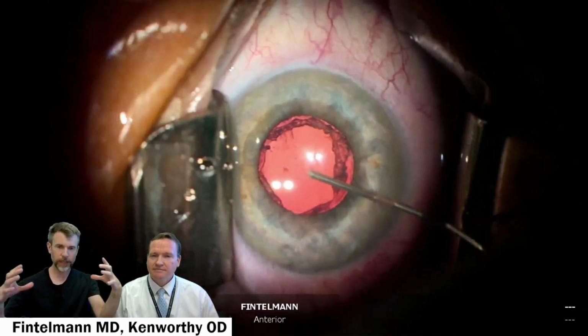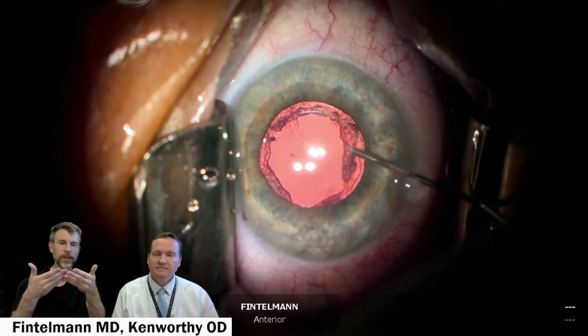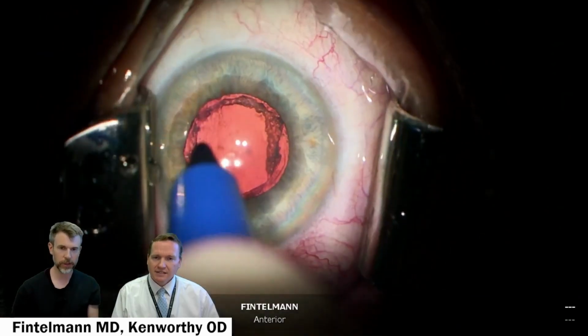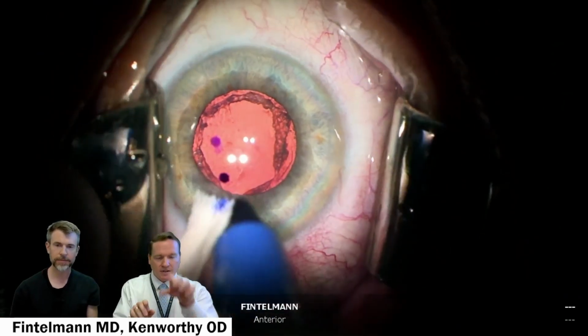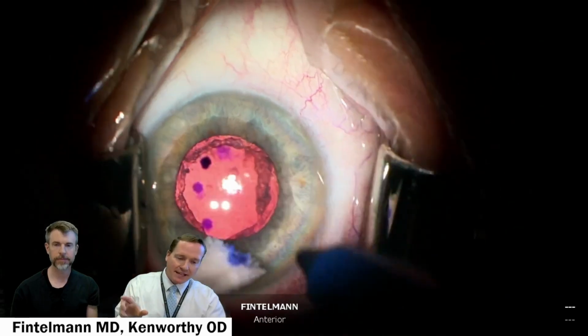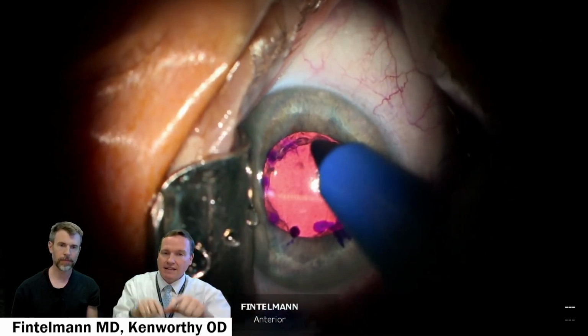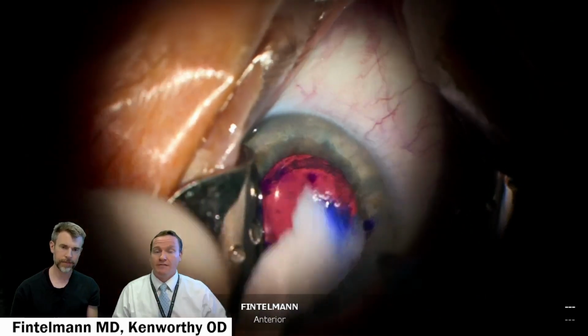But if the periphery of the patient's cells are still adequate, they can be used to fill in that gap or the defect that will be created here in a moment. I think that's a key because you want to measure central endothelial density, but also peripheral density. And as long as the peripheral is strong enough, like we just heard, then it can migrate in towards the center. And that's what we're relying on for this type of surgery.